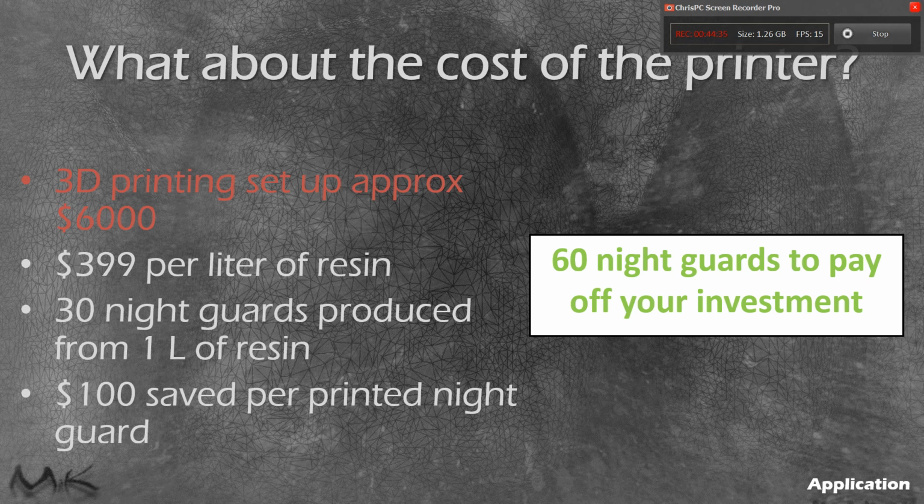it's fun too. I give my assistants the ability to do the scans on these. I give my assistants the ability to take a crack at designing them, and they find it's really fun. It's a delegatable task that saves us a lot of money and really pays off our 3D printer for other types of projects as well.